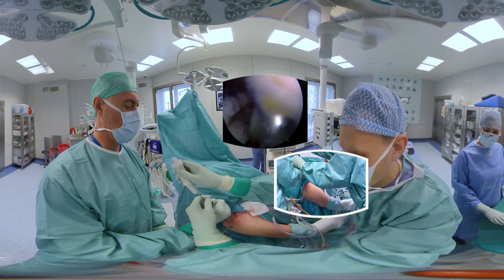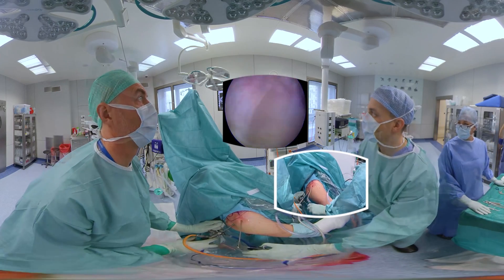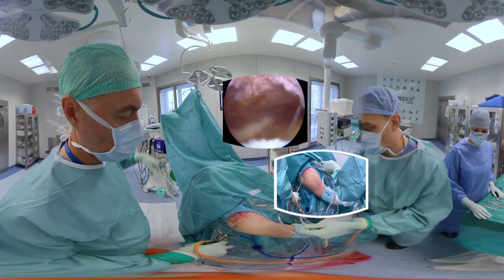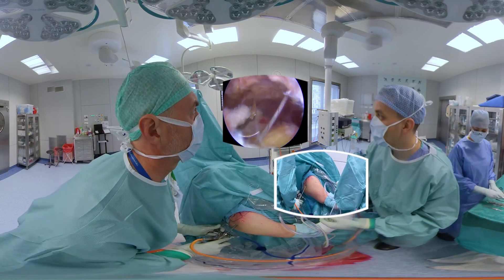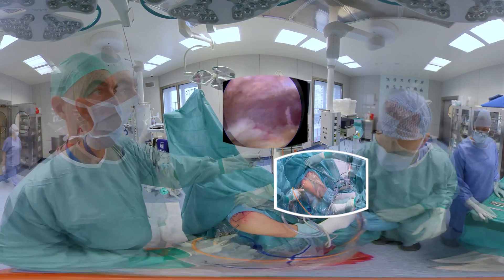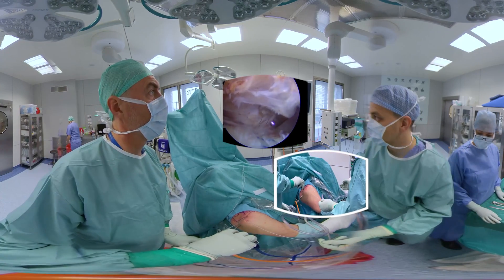Next comes the posterior medial anchor. After insertion, all sutures are passed, this time through the posterior part of the supraspinatus tendon. Following that, non-sliding knots are tightened, and one pair of suture threads is cut while the other pair remains.